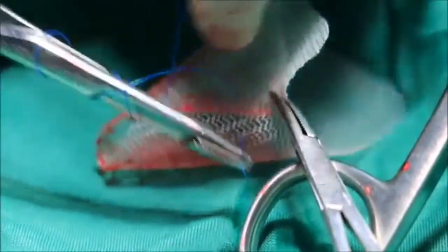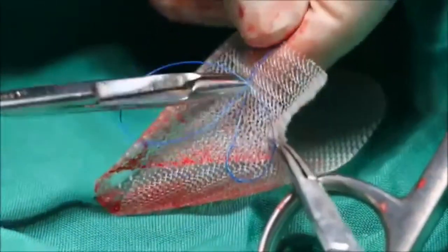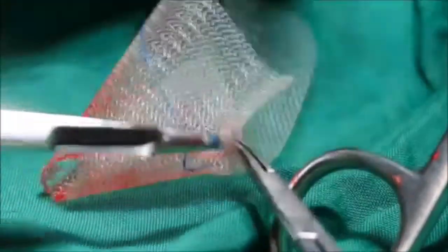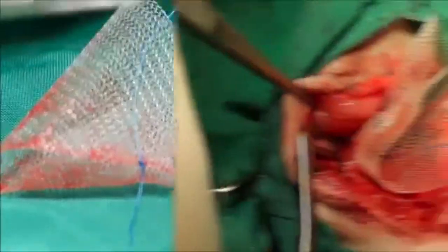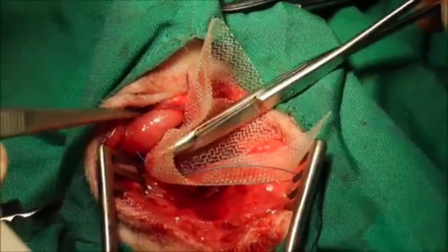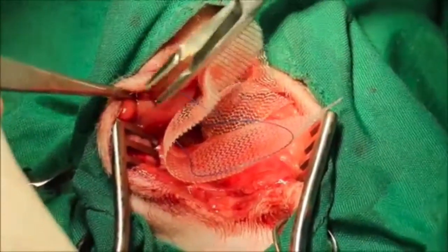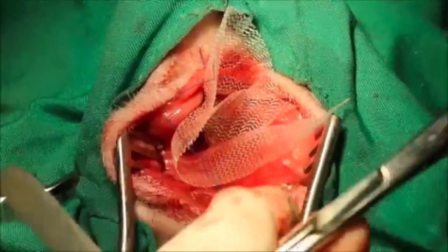Basically, you're sealing it. Okay. You figure out that that's the size of the hole that you need to fix. If you fix mo yung mesh in that shape para hindi siya mawala sa shape na yan as you install it, and then you attach it to the remaining muscles around that area. Okay, this is how you fix a perineal hernia with a surgical mesh.